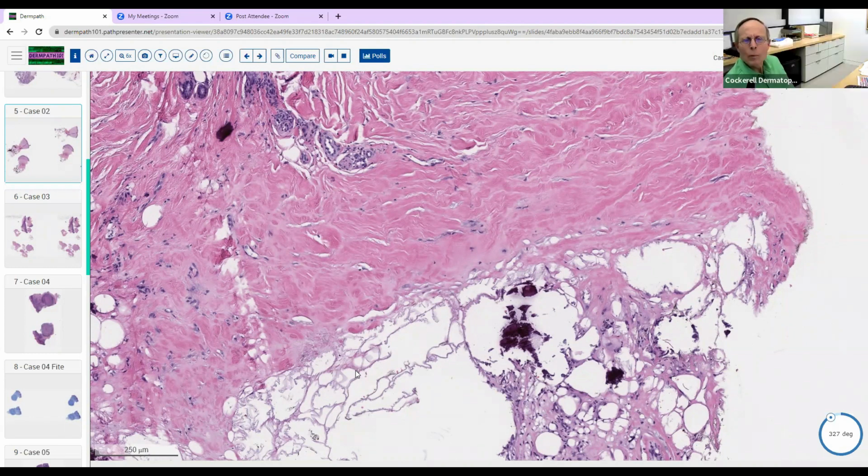Yeah, and again, calcinosis cutis is either just idiopathic calcification that happens for unknown reasons, like scrotal calcinosis, that sort of thing, or it can be related to trauma, something like that. But if it's dystrophic calcification, that's really a form of calcinosis cutis. That's almost like a generic term. So here we've got other features than calcification.